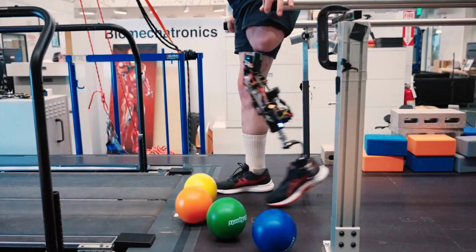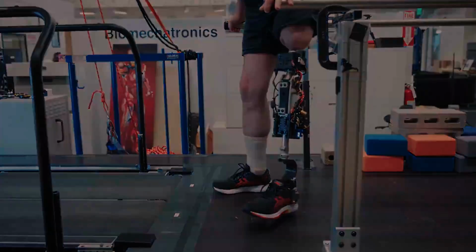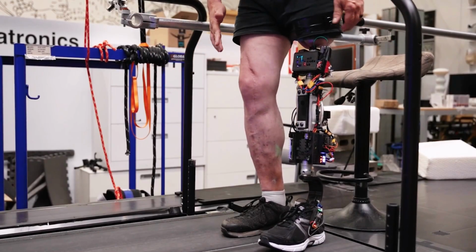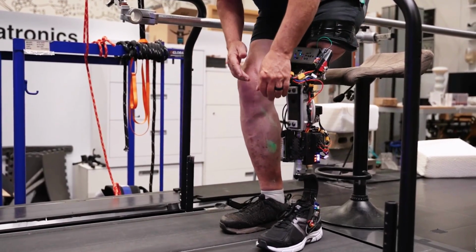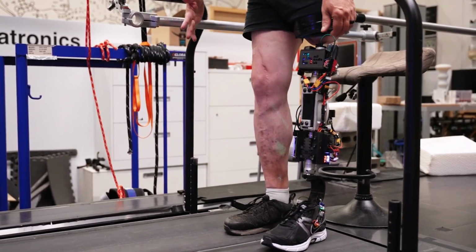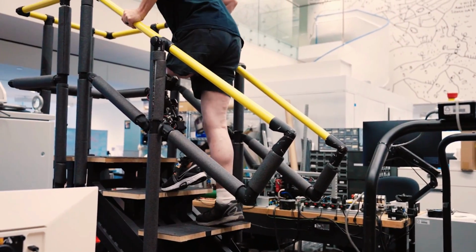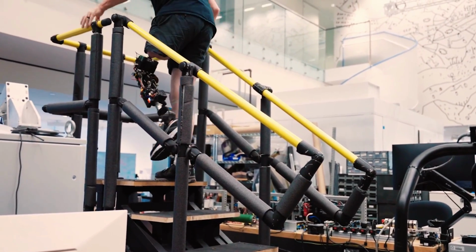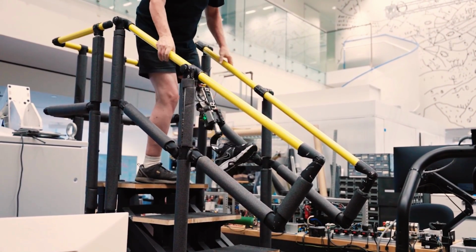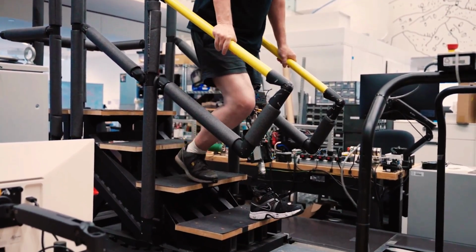Two study participants who had received the combined AMI and EOPRA system performed better at numerous physical tasks involving the prosthetics than others who had the AMI surgery but not the EOPRA implant, and a third group who had neither AMI nor EOPRA. Additionally, the researchers found that the two participants who received the combined bionic knee system showed significantly greater feelings of agency and ownership of the prosthesis as part of their body.